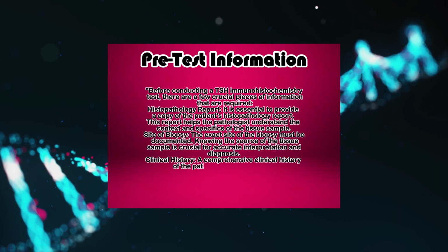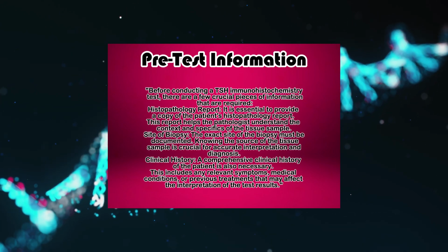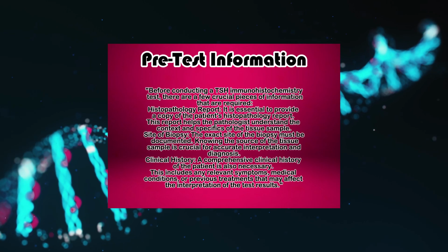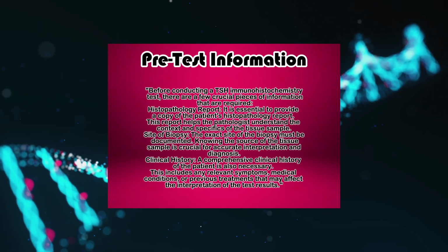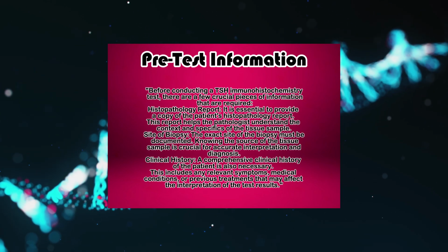Pre-test information. Before conducting a TSH immunohistochemistry test, there are a few crucial pieces of information that are required. Histopathology report. It is essential to provide a copy of the patient's histopathology report. This report helps the pathologist understand the context and specifics of the tissue sample.